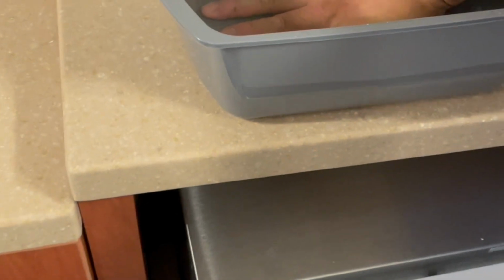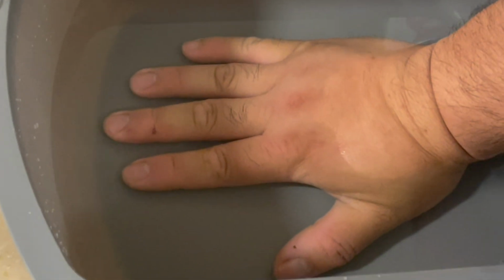All right, I have a cool bonus tip for you. We have a hand immersed in water, and if your ultrasound probe is waterproof, you'll have to check the manual, you can actually just use water as your jelly and put the ultrasound probe on top of the water. This will be good in case you're looking for foreign bodies inside the hand, or a large fluid collection in the hand. As we can see on the ultrasound screen, we can see how much the area lights up.